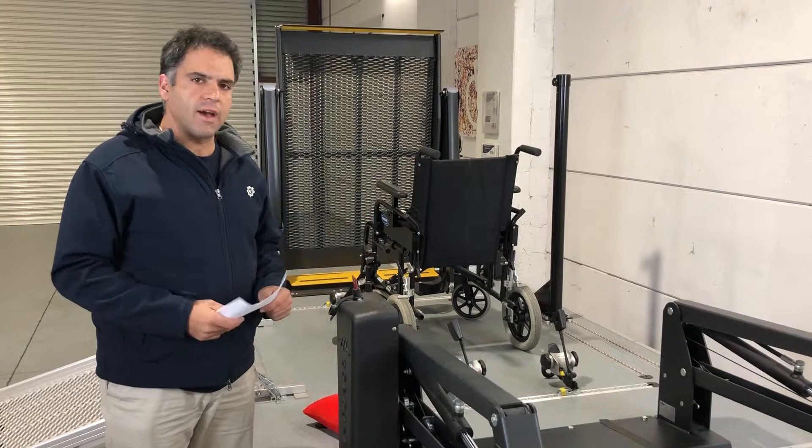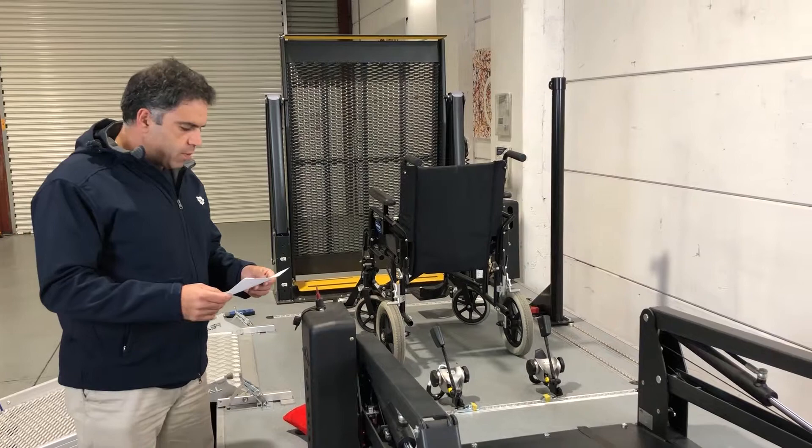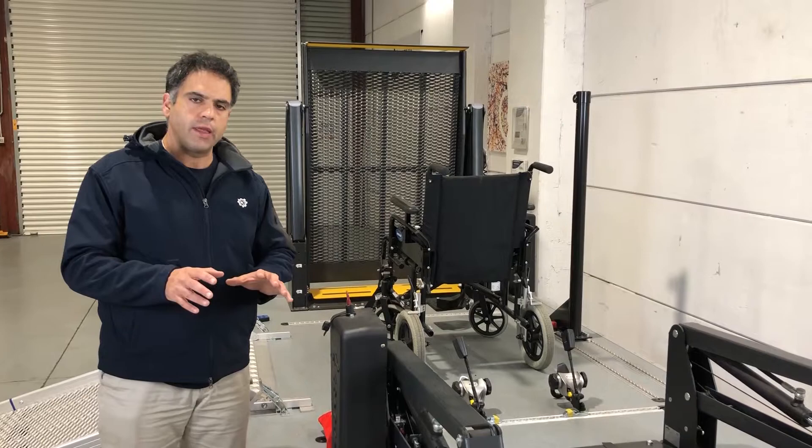Today's question is all about restraints. I've got you up here at our rig with the restraints because today's question talks about crisscrossing the restraints for wheelchairs from the back. So the question is: can we crisscross the restraints, and if not, why not? And how do we tension the restraints? First, I'll explain what the crisscross is.